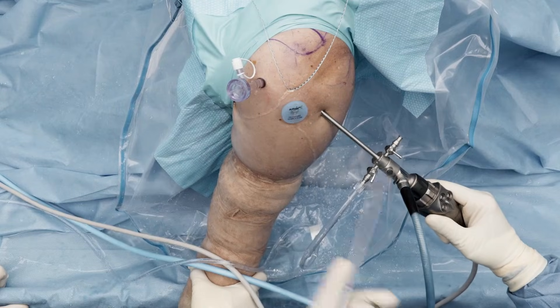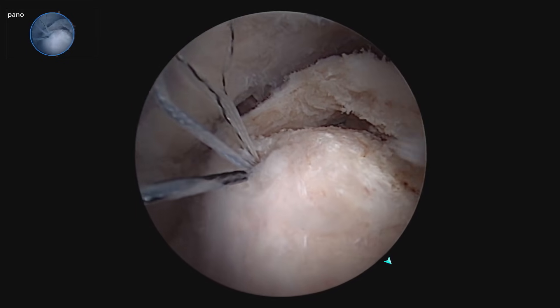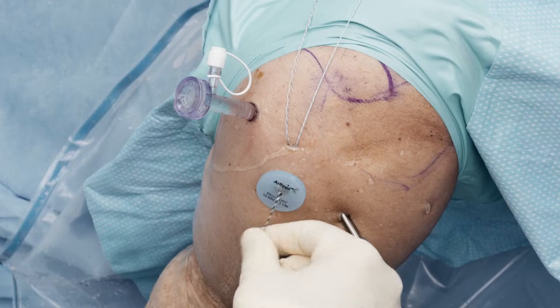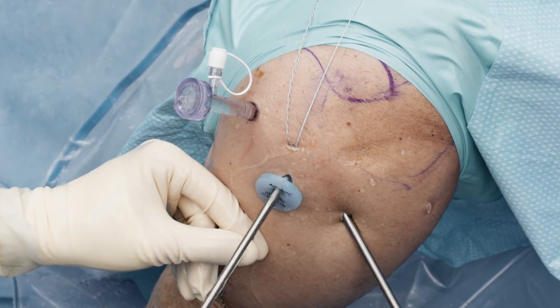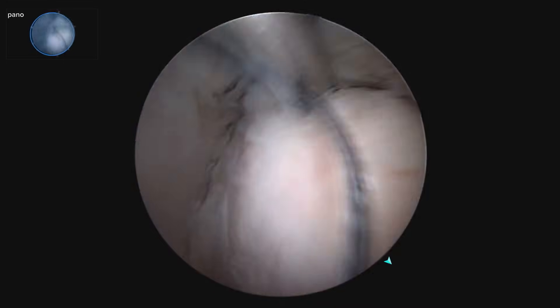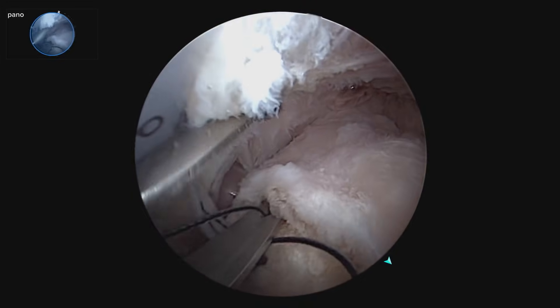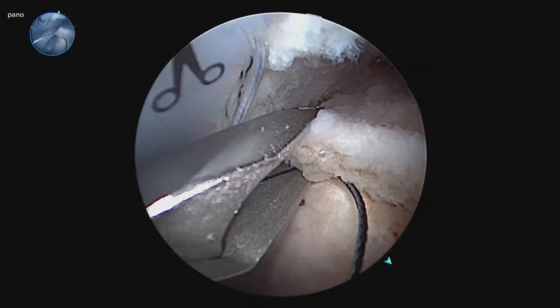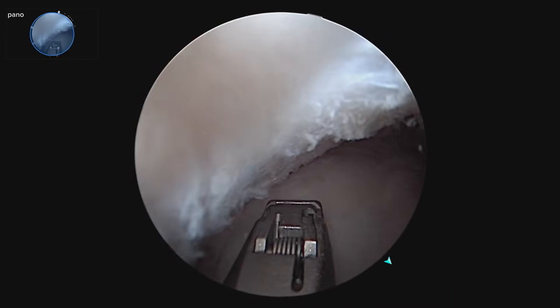We're going to go ahead and retrieve our working sutures one at a time out of our lateral portal, then we'll take the scorpion. I'm going to add the working stitch to the side loader as we come in. I'm going to take a feel and see how much cuff tissue I want to grab, pull and reduce, and go into the anterior extent of the tear. That looks good — I'm going to do one there.